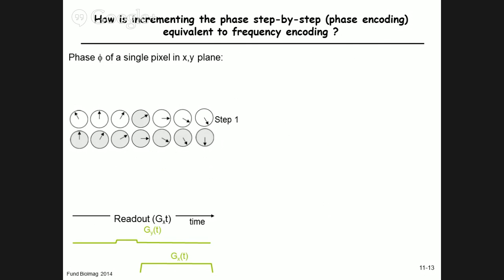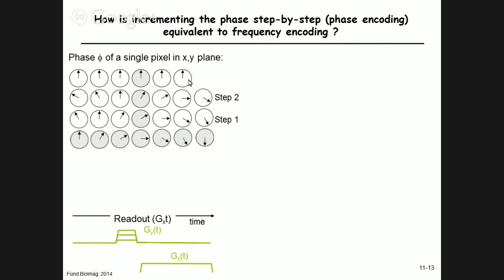But instead of talking about numbers in a matrix, we're looking at the magnetization vectors that are being measured. Okay? Somewhat. Okay. Well, step two, we'll have a stronger phase twist because the gradient is twice as strong, so that's the starting phase. We'll turn on the x gradient over time. This is what the computer will record through the digitization. We'll do a step three here. The phase, you can see the phase is now twisted even more according to the application of the gradient along y. Here, 3 times as much, and then by the application of the readout gradient, after a certain time, it's twisted. For all of them the same way, but they have different starting phases.